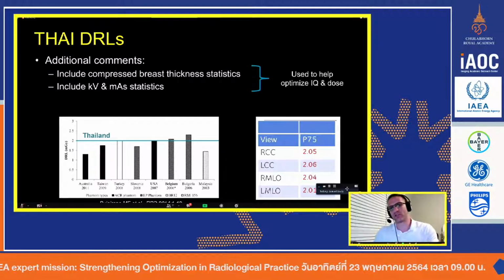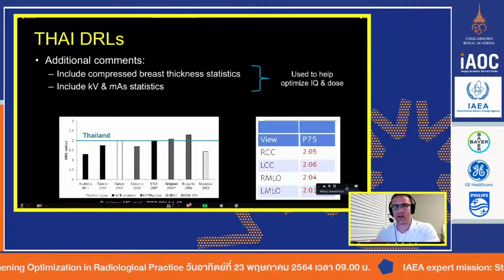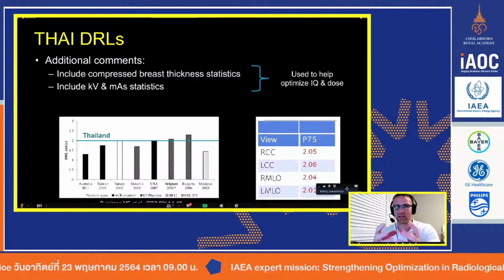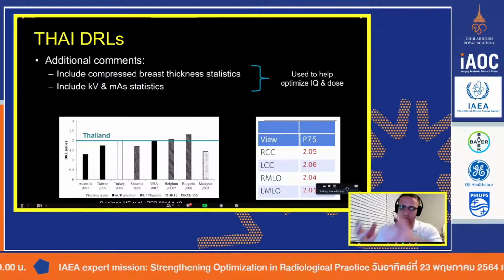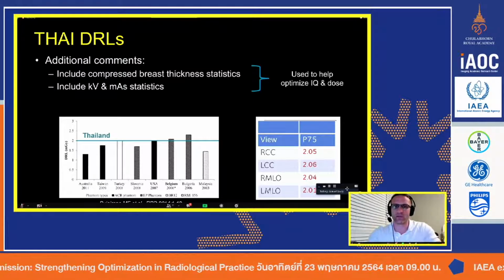But as you are shifting towards dose collecting software, now every woman that comes in gets imaged. That is reported and collected in the system, and the mean glandular dose is reported there. Then that data will be processed at a higher level.